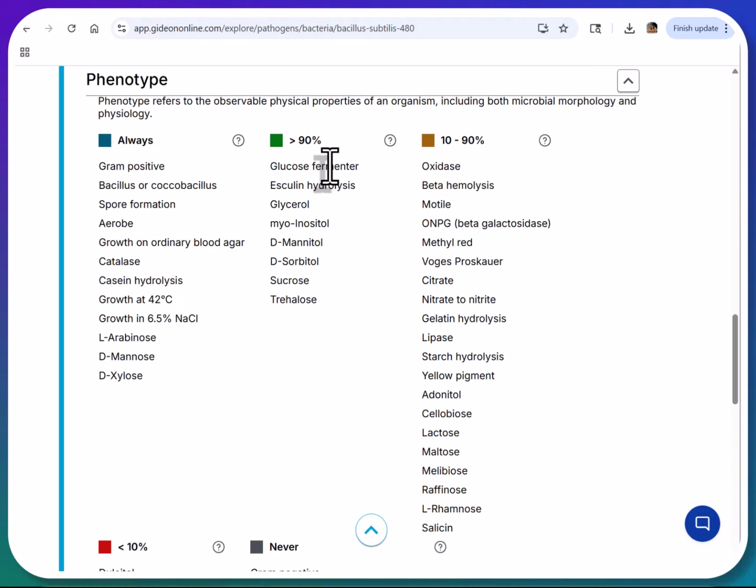Yes, they're gram-positive or gram-negative, they have certain characteristics, but some characteristics are just not typical. I recently identified with our diagnostic mass spec, I had 2 colonies on a plate. One was white and the other one was bright yellow. The gram stains of both looked like Micrococcus luteus because they were arranged as a tetrad, 4 organisms stuck together. So the gram stains look exactly the same, but the morphology wasn't. And when I used my diagnostic mass spec, both of them turned out to be Micrococcus luteus. And it's very uncommon to have a non-yellow Micrococcus luteus.